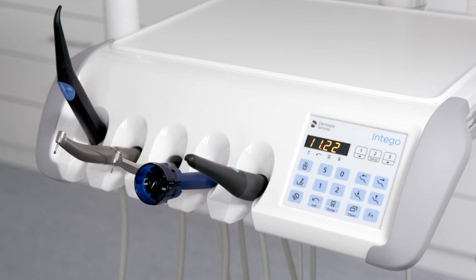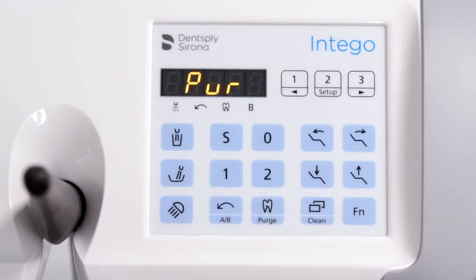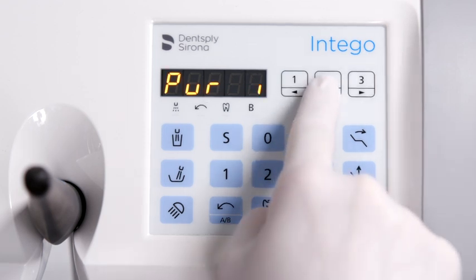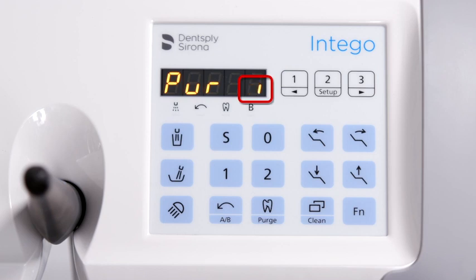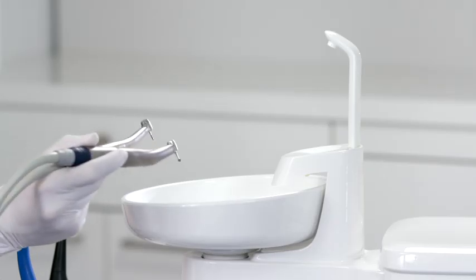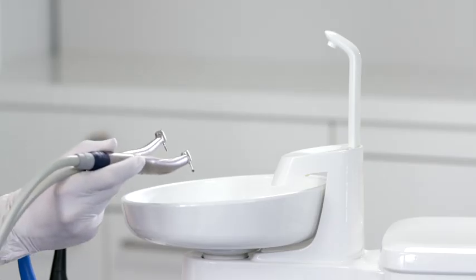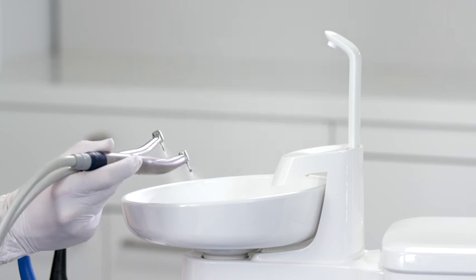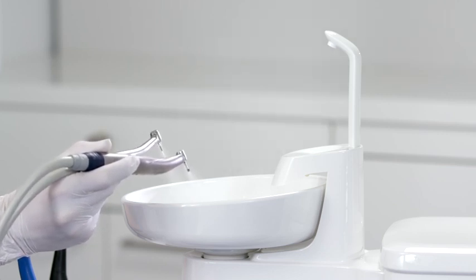Flush the instruments using the purge function after each patient. With all instruments placed in their holder, press the purge key to open the hygiene programs. Activate the purge function by pressing the middle set favorite key — a revolving element shows successful activation. Take the instruments out of the holder and hold them over the cuspidor. The instruments will start flushing automatically for the set time.